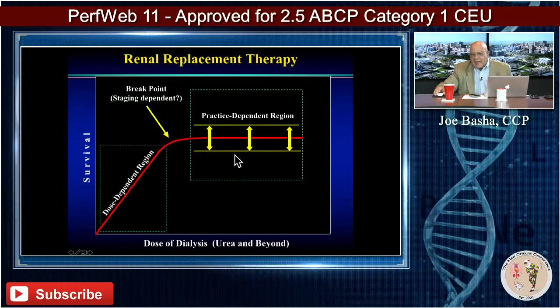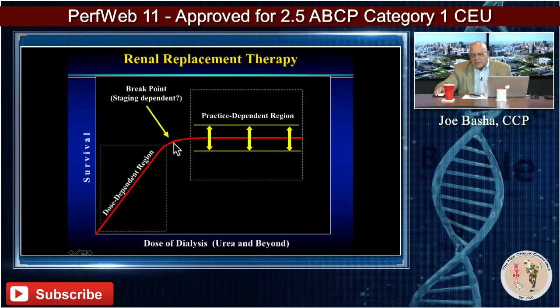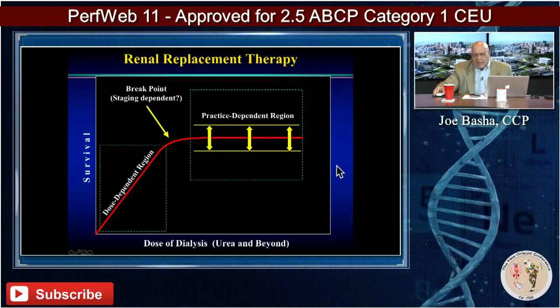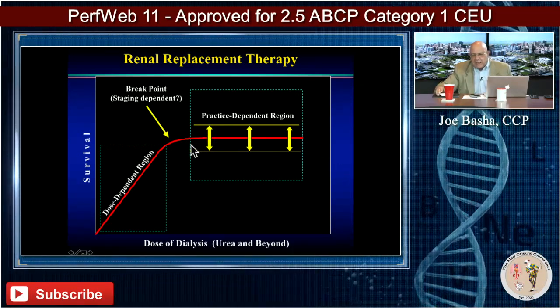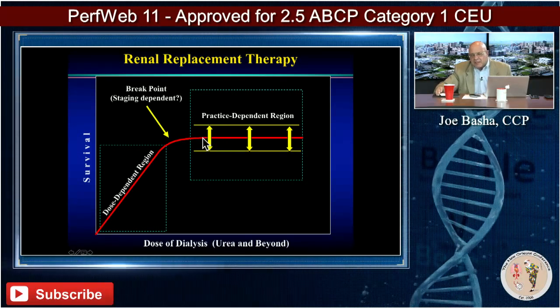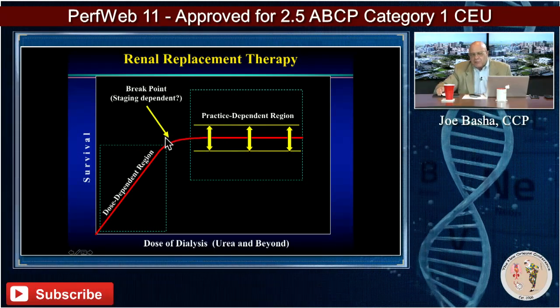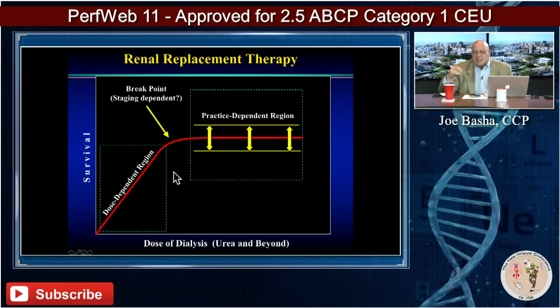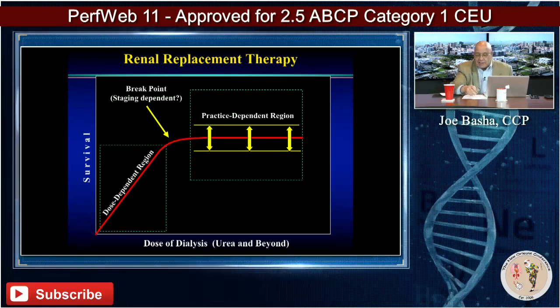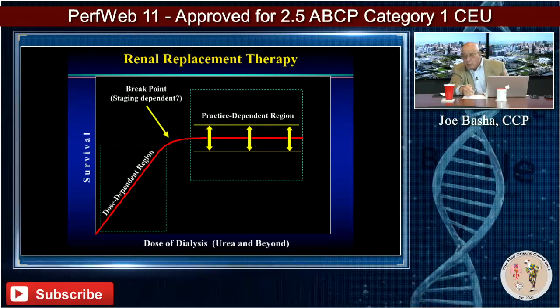But this area here at this breakpoint tends to be a practice-dependent region. Some people feel it should be here, and some people feel it should be here. But from the data, there's no improvement in survival once you reach some point. The question is, we don't really know what that point is. And I think that's something that's just never been well defined.